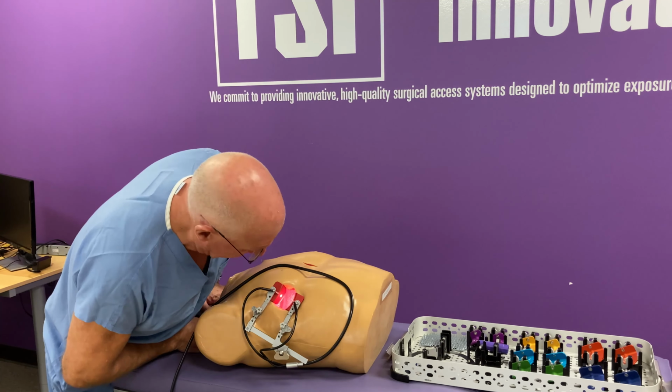Now we have a brightly lit incision. Even if you're using a headlight, this will be helpful, because it will reduce the shadows from the headlight. Now, if you notice, this is what you would have with a standard retractor. This is what you have with the ULTRAVISION retractor system.